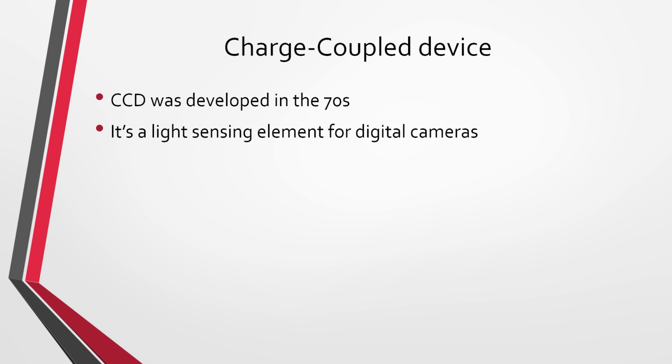Okay, it's the most common thing. So in your phone, you have a CCD right there. So there are thin film transistors in displays, and there are CCDs in cameras. So these technologies aren't so foreign. They can just be applied to radiology in different ways. And we can utilize that technology that was maybe developed for other things, and we can use them to do our digital imaging process.